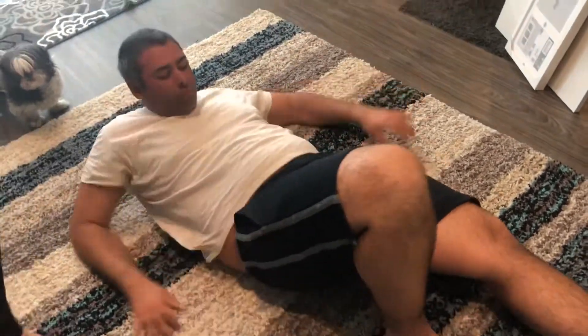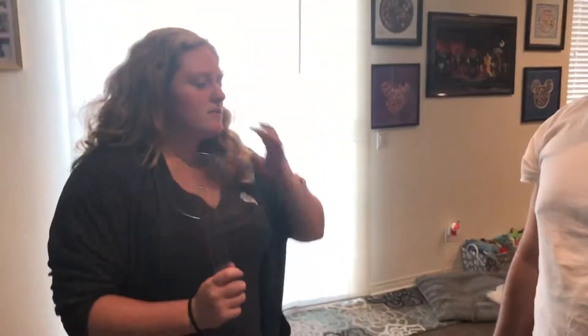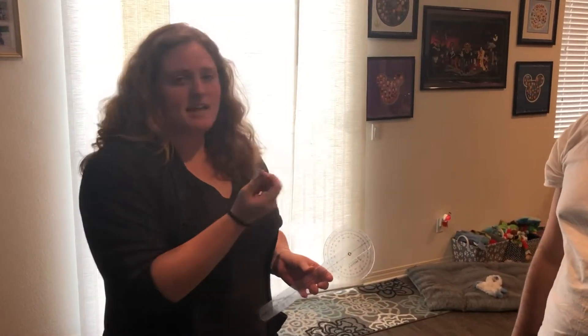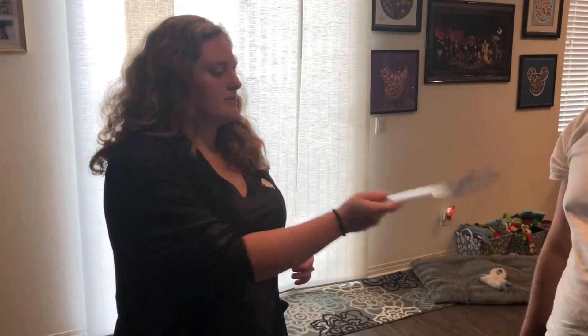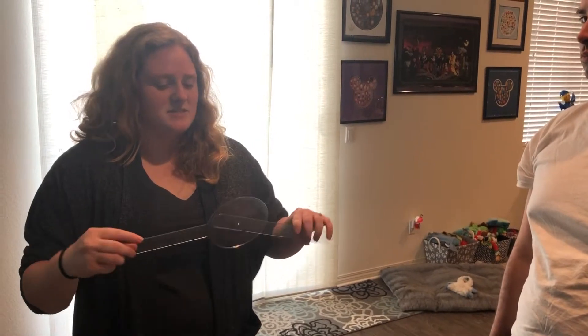Nice job, Christian. So today we went over the blood pressure measurement, we went over the body fat test with the skin calipers, we went over the waist measurement and the hip measurement, we went over the YMCA sit and reach, and then we went over flexibility using the goniometer. I hope this helped everybody understand what to do with these different tools, and we hope you enjoyed watching. Thank you.